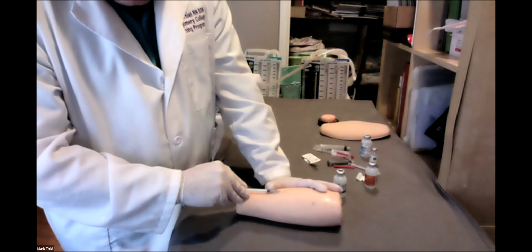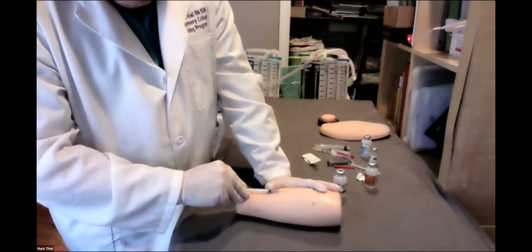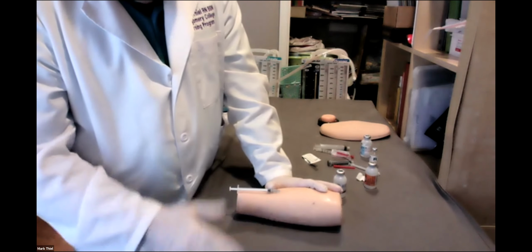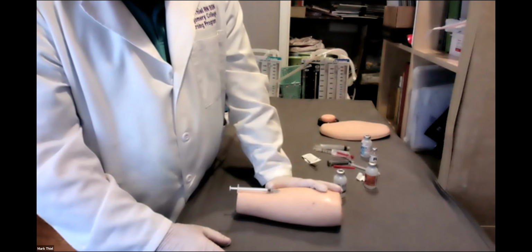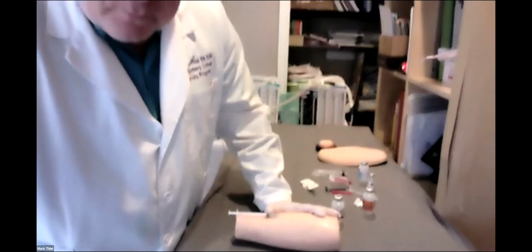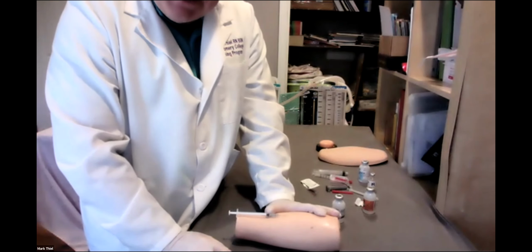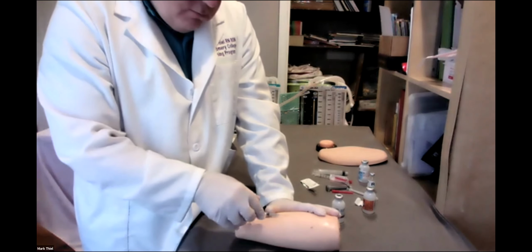Inject very slowly, even though it's 0.1 ml. Slowly. We all know what happens, don't we? It creates a raised area of the skin in a circular pattern called the wheal. W-H-E-A-L creates a wheal.